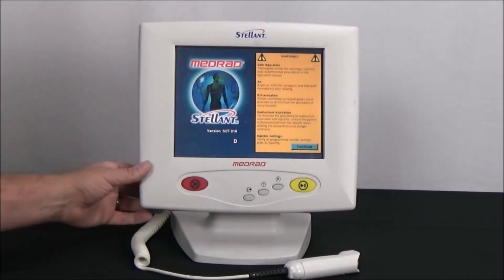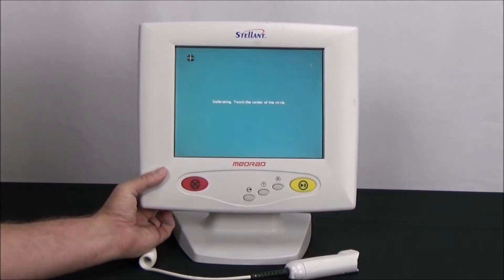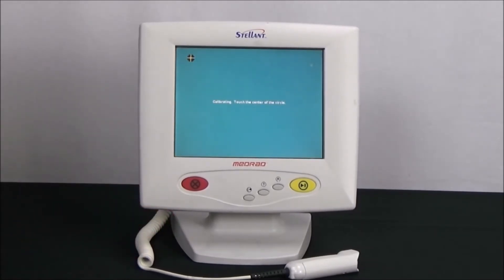The touchscreen calibration mode is accessed from the safety screen by simultaneously pressing both display brightness keys on the left rear of the touchscreen.